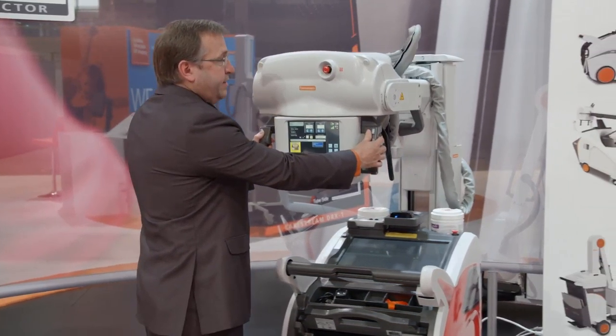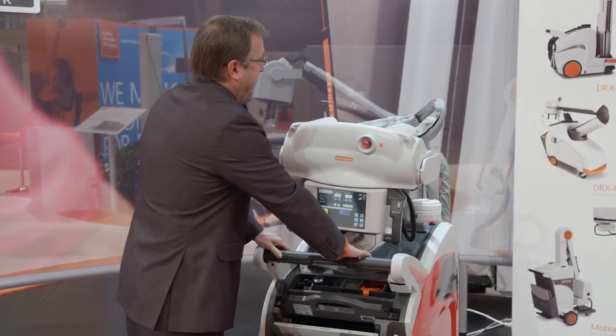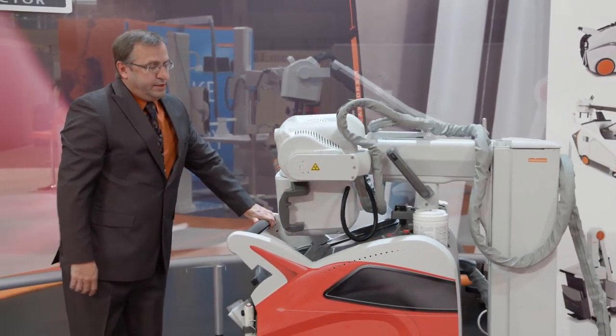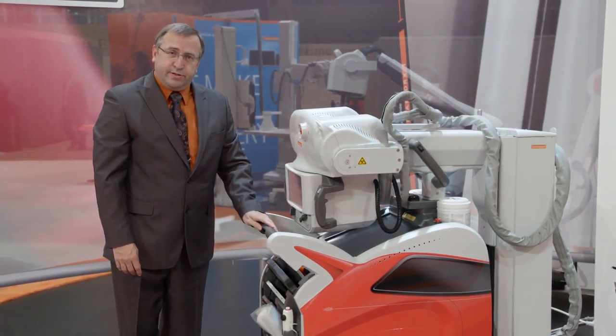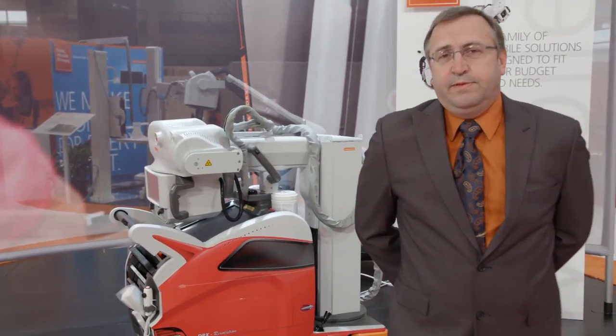So this system is uniquely designed to fit the needs of the radiographer in their daily activities. It is truly a unique system and we're very proud to share this with you today. We hope to see you more at CareStream. Thank you very much.